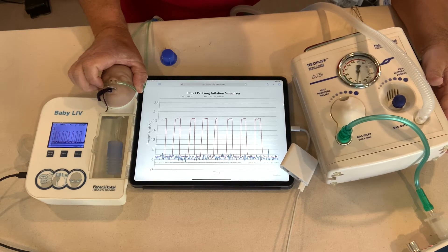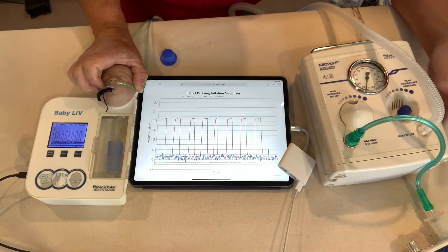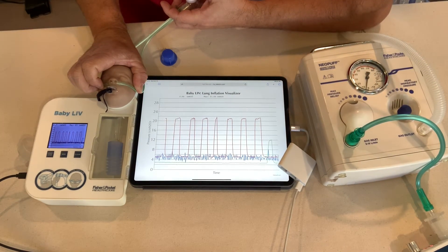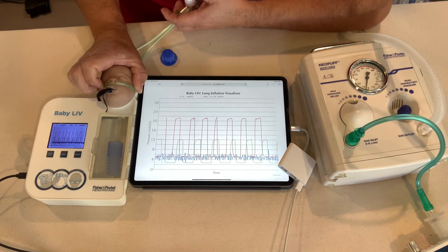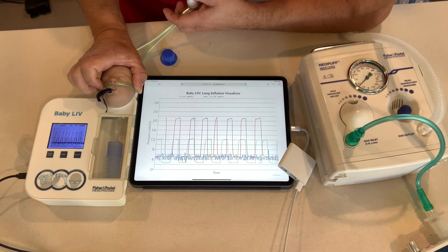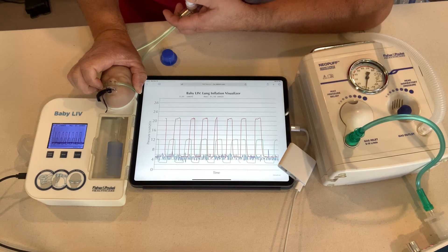So if I was a care provider, I'd be like, 'Okay, that's working — I've got 5, it says so on the Neopuff.' But the baby is actually getting 3. Then when I resuscitate — breathe, two, three, breathe, two, three — remember I had it set to 20 over 5, it's only resuscitating at 12 over 3. So I'm getting a PIP of 12 over 3 mechanically in the lung of the baby, while the Neopuff is telling me I'm actually giving the baby 16 over 5. As a care provider, that's the only information I'm getting, so I'll think there might be a leak and I need to give this baby 20.